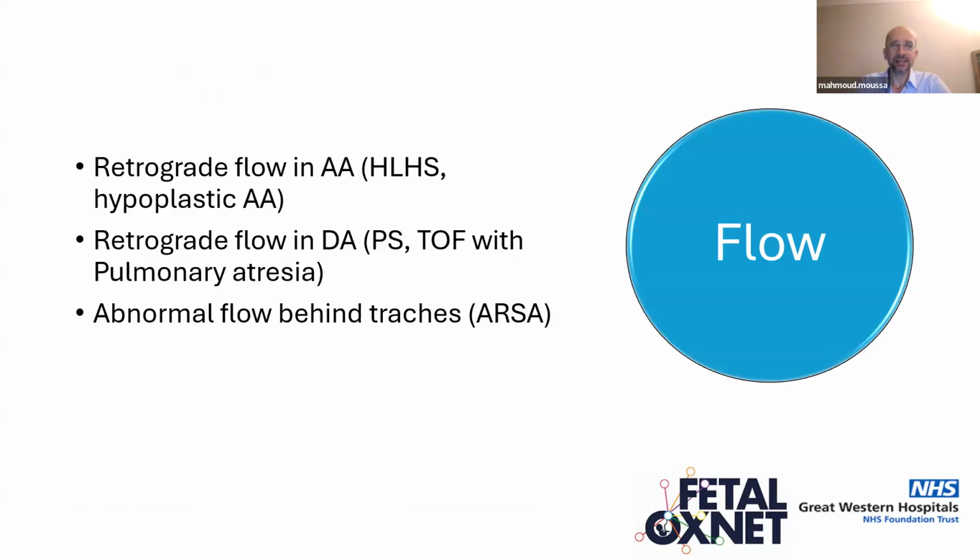And then we move to the next part, which is the flow. What you would expect is antegrade flow, or forward flow, in all your vessels. So if you get an abnormal flow, if you get a retrograde flow, then this is a clue for the diagnosis of heart disease.